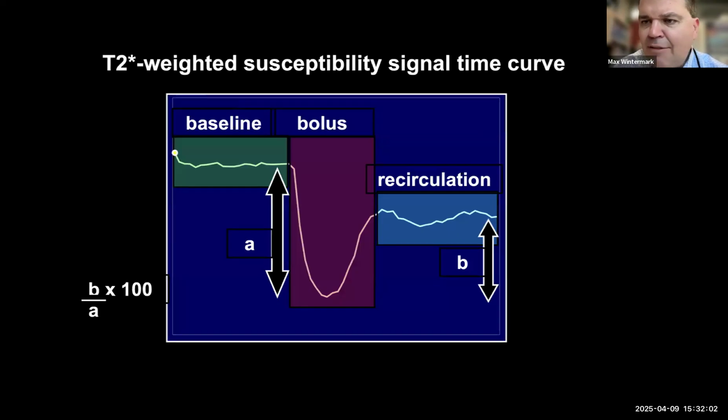As you know, there are different types of perfusion imaging. There are basically three different types. One called dynamic susceptibility contrast imaging, DSC. One called dynamic contrast enhancement, DCE. And finally, there's also another technique called arterial spin labeling, which we typically abbreviate as ASL. And I'm going to give you a little bit of information on those three perfusion imaging techniques.